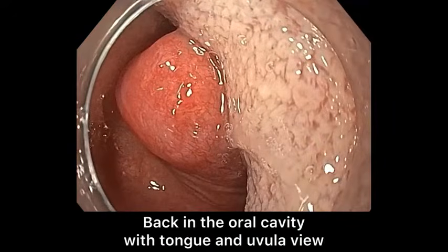And now we are back in the oral cavity with tongue and uvula view. Let's see the same assessment now performed in normal video speed.